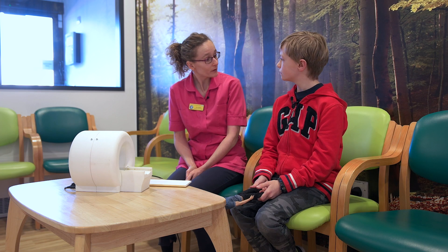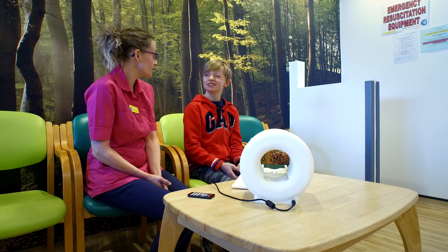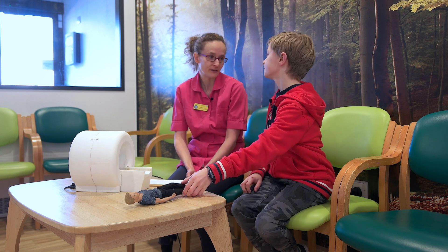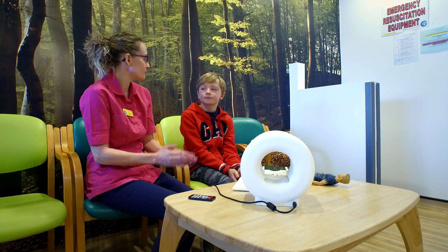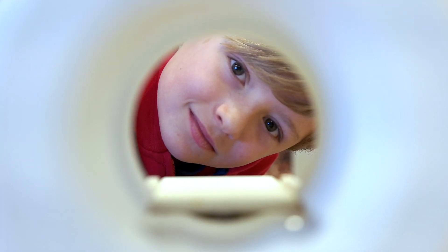You've come to have an MRI scan today, is that right? Yeah. What are you having a scan of? I think my spine. Your spine, that's right. So what I'm going to do today, Hayden, is tell you all about what an MRI scanner is. An MRI scanner is a big, giant magnet, and it looks like a ring donut with a tunnel through it.